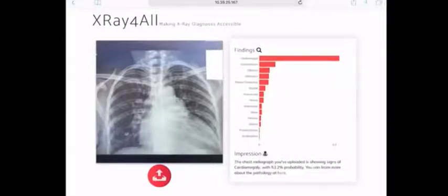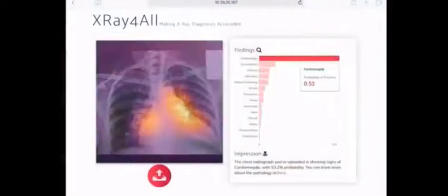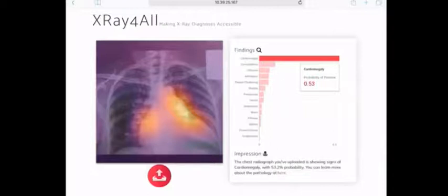Now if you're a clinician or a doctor in a different part of the world, you might want to know: is this algorithm looking at the right thing to arrive at its final diagnosis? Towards that goal, we've also built the ability for the algorithm to show exactly where it's looking when it comes to its diagnosis. And here we can see that the algorithm is looking at the heart.